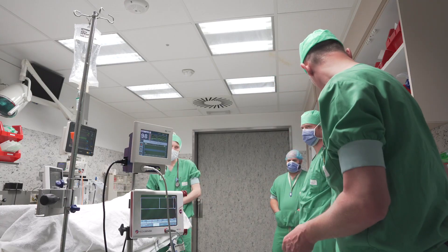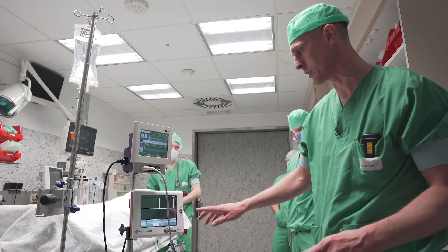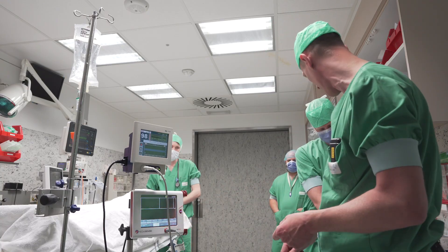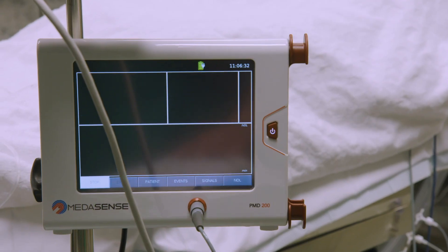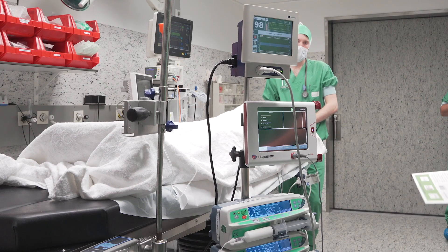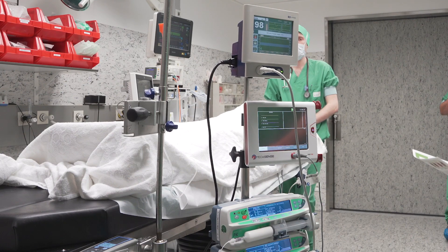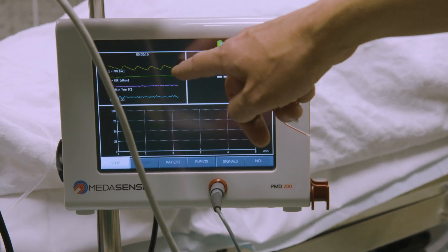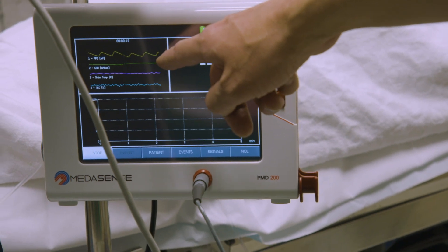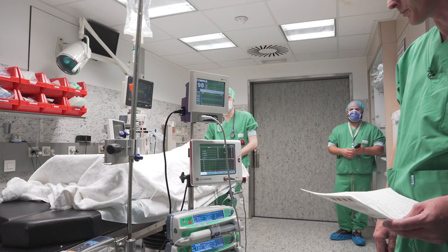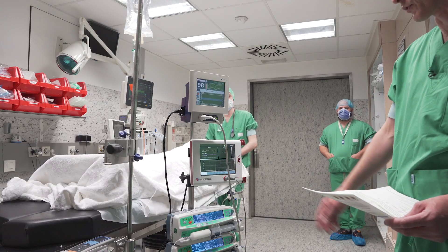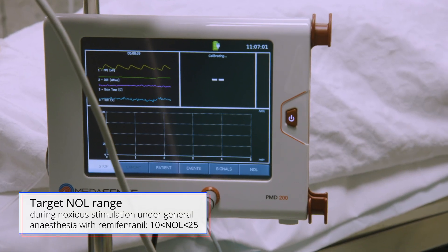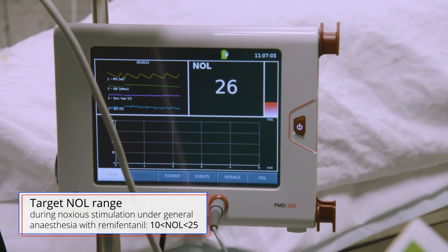For the nociception level monitor, we first enter the demographic data, although for the algorithm it's not important. It's just a source of information if you want to use the data for research later. Now I press start and immediately the device starts collecting signals. We have four signals on screen: the plethysmogram, a skin conductance, a temperature wave, and a movement wave. The system is now calibrating and will start with the first number. In the awake condition this number is not very informative for me — I wait to use this device after the induction.